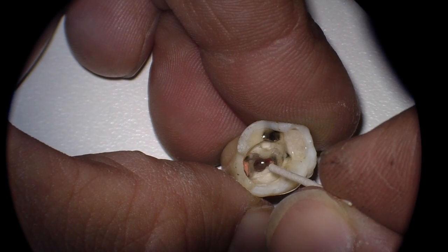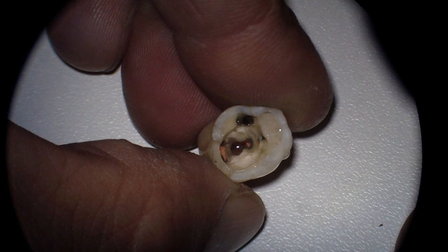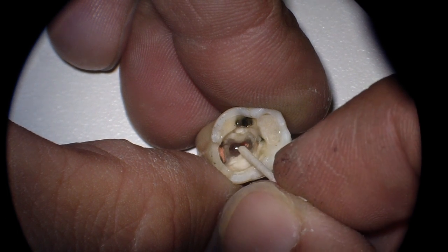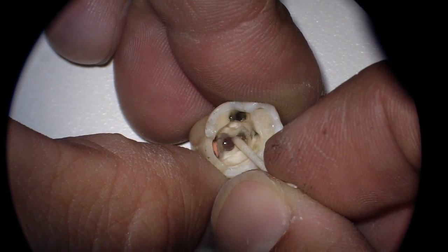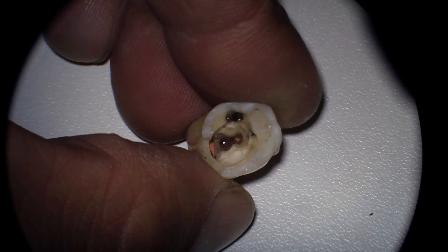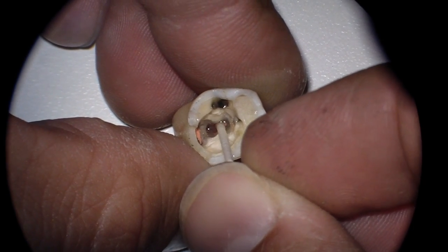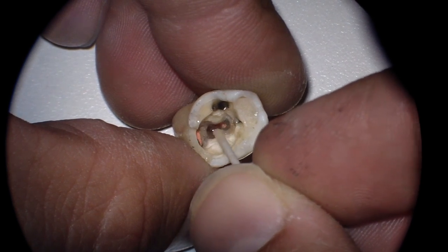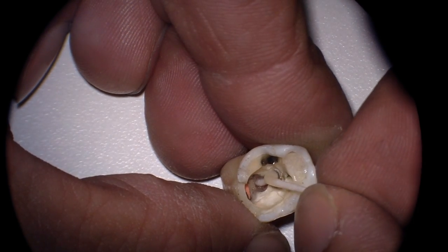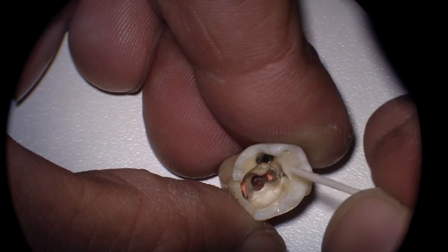So here, what I've done is I've taken an extracted tooth just for demonstration purposes, and I'm going to go through using MTA quickly in placing and repairing this perforation. Normally we'd have hemorrhage, so we'll take a paper point backwards and try to contain the hemorrhage. Placing MTA in a hemorrhaging site is fairly difficult at best. So there we go — that's just some red wax that I've placed in there.